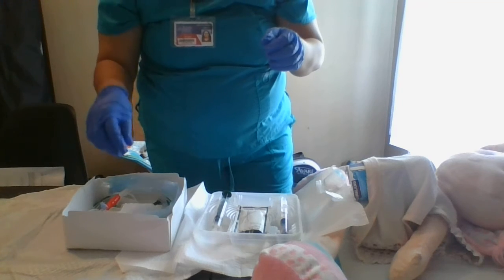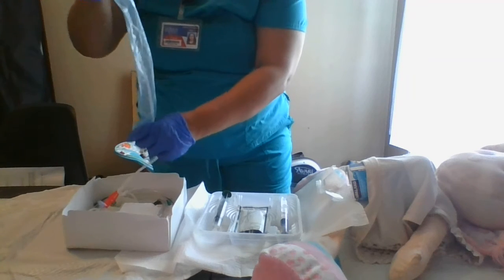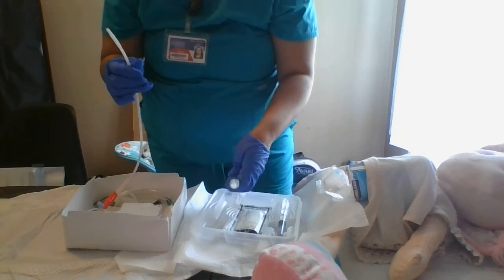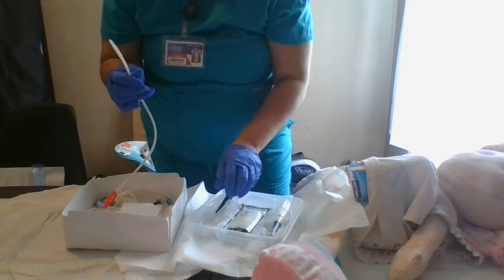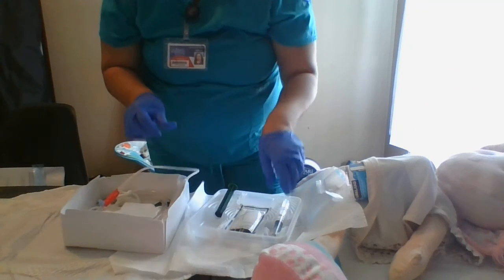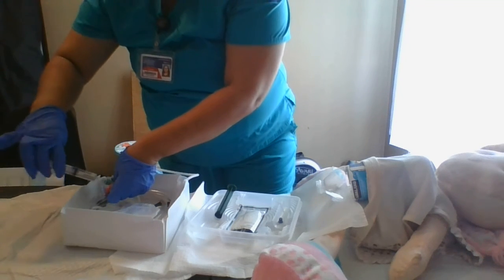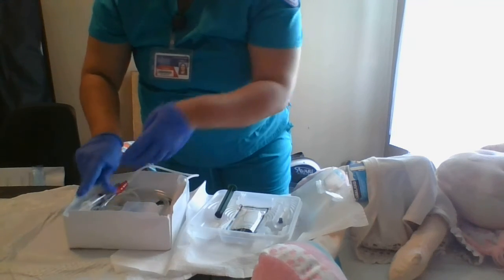I will now proceed to get my kit ready. I will remove the catheter shield. This is now trash. I will open my lube and I will insert the tip of my catheter into my lube. Put it back in the sterile place. I will now attach 10 cc's of saline for my balloon, still in the sterile kit.